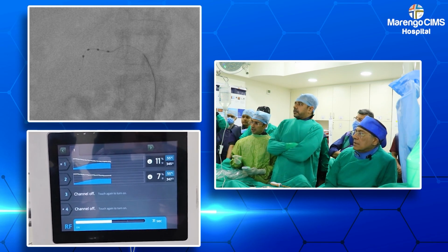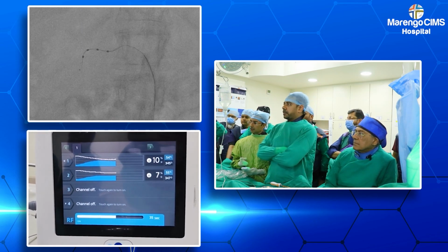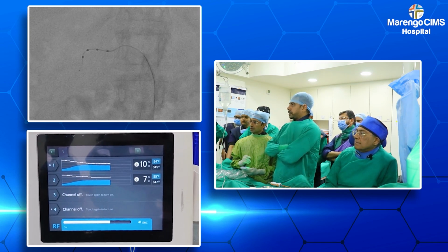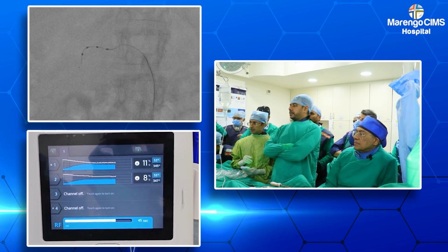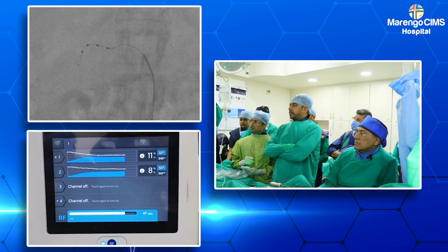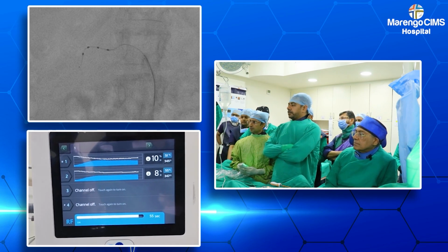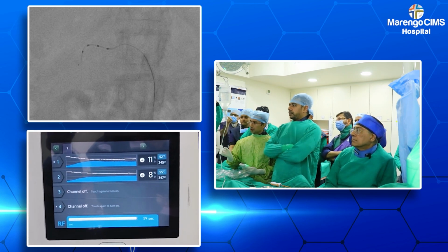So this is an AI enabled system wherein if there is any overheating or loss of contact, the system will switch off automatically, and that is very important for the safety of the patient. So roughly we do it for about 60 seconds, after which we will switch it off. Now it will switch off automatically. So now you can see the beeping sound and now it will stop.